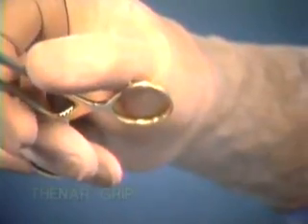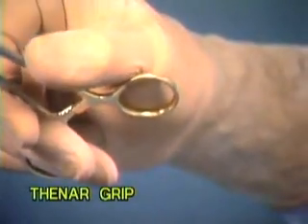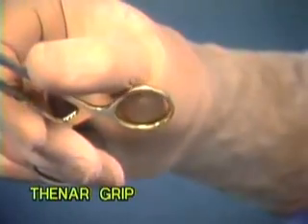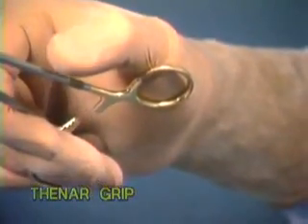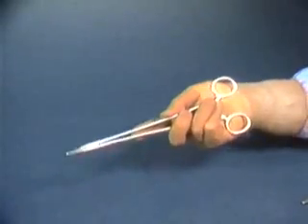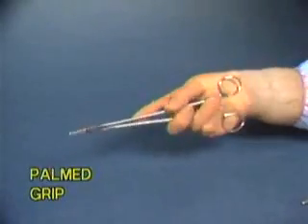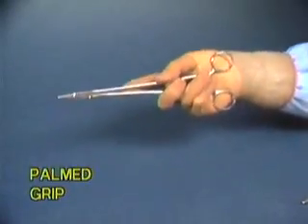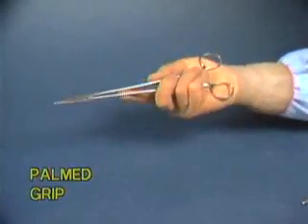In the thenar grip, pressure by the heel of the hand releases the lock, which is faster but less controlled. The last two grips serve totally different needs. The palmed grip is used when driving force is needed to place a needle through dense scar tissue, fascia, cartilage, or thick skin.